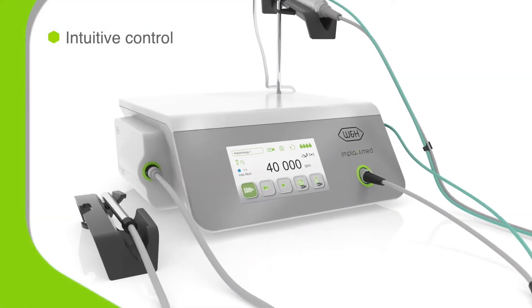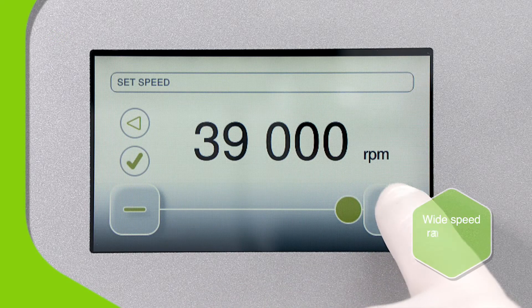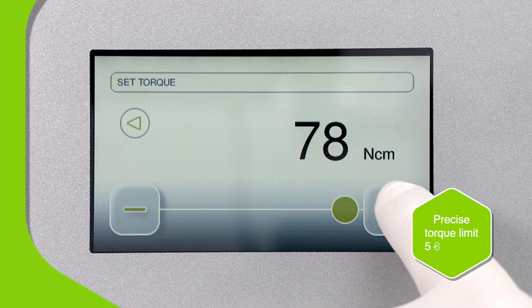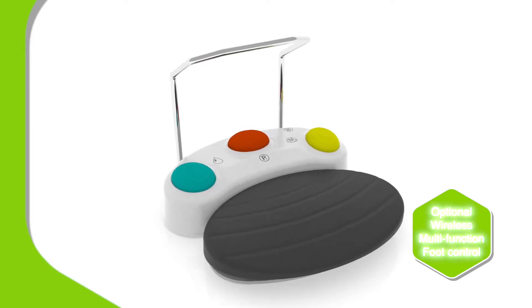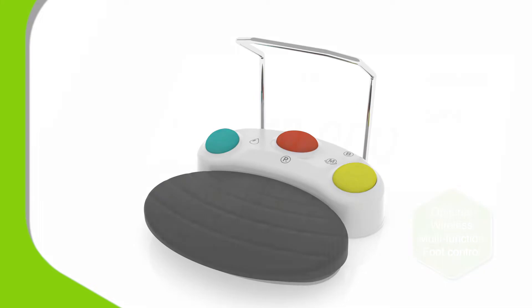ImplantMed Plus stands out with its clear and colorful user interface. Simply choose the speed you need, select your required torque setting and you're ready to go. Functions can also be accessed using the foot control, so you can do all this and much more at the tap of a toe.